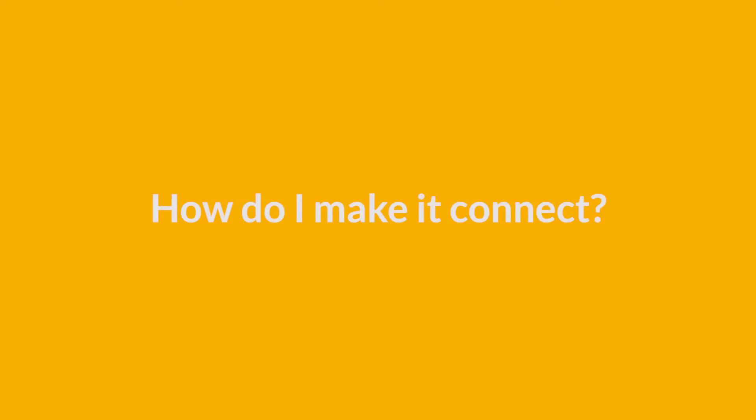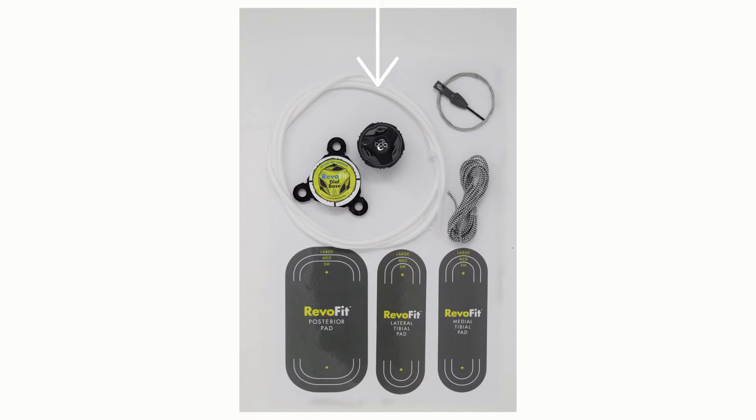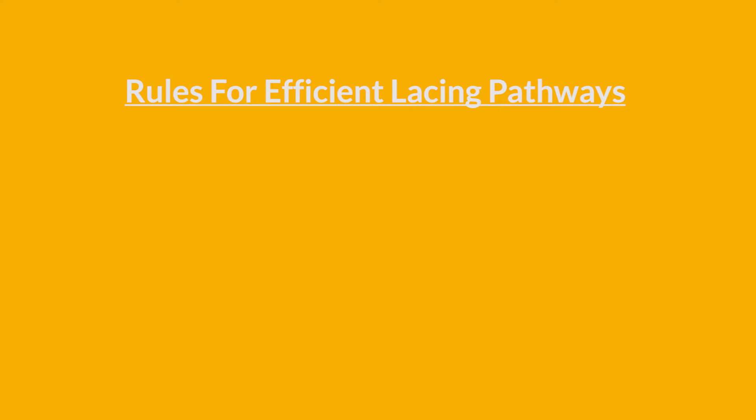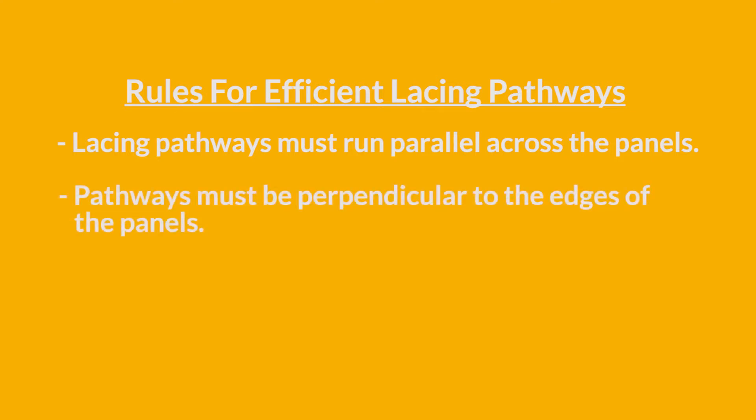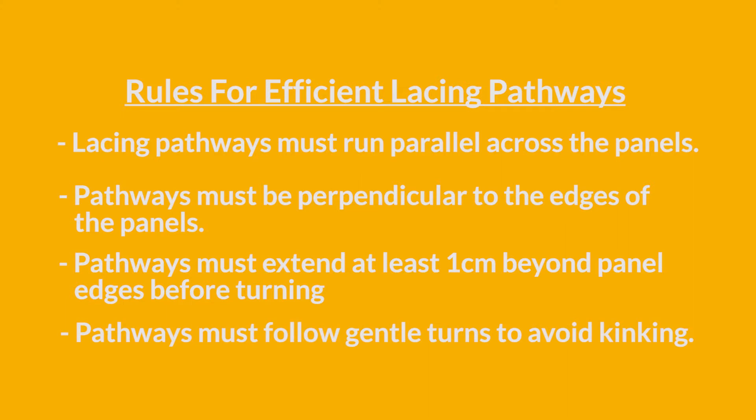How do I make it connect? To connect the panels and the dial, you will use the tubing that comes in your check socket kit. Again, as we discussed in our socket design course, there are a few rules to follow to ensure efficient adjusting. The lacing pathways must run parallel across the panels, perpendicular to the edges of the panels, extend 1 cm beyond the panel edges before turning, and follow gentle turns to avoid kinking the tubing.